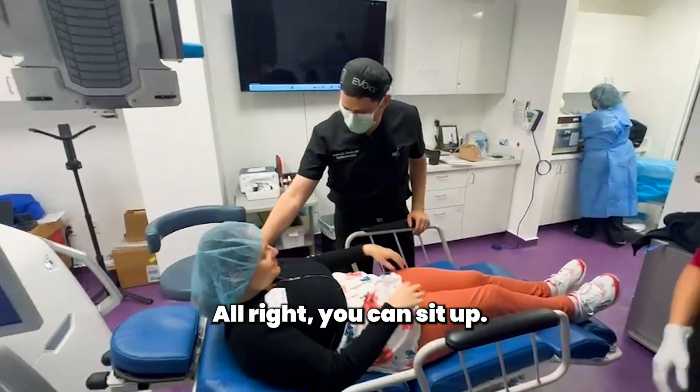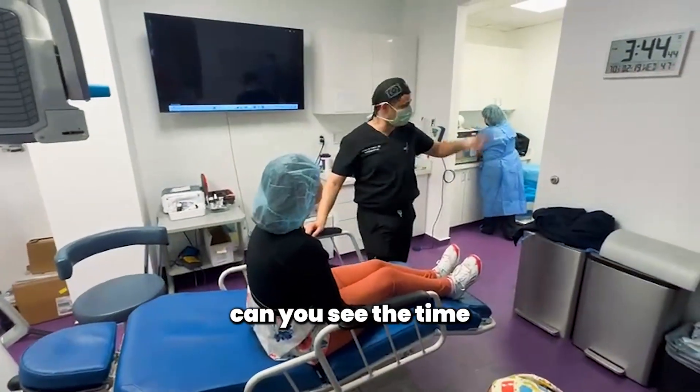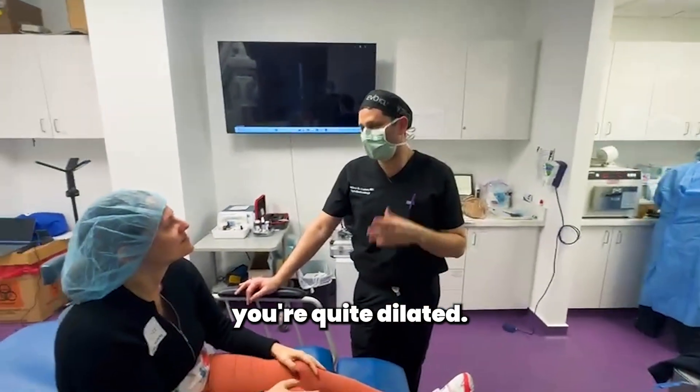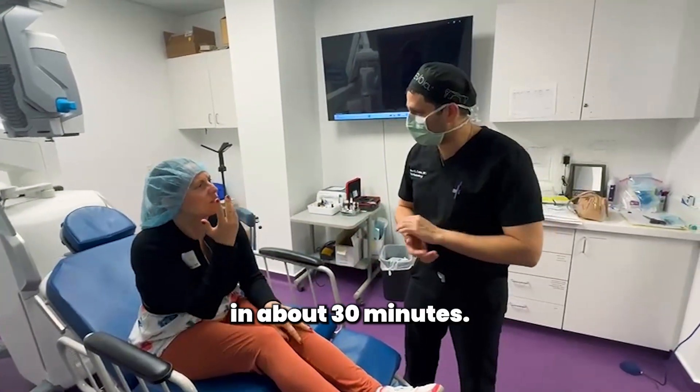Okay, go ahead and sit up. How are you feeling? Good. Can you see anything? Can you see the time? Yeah. Perfect. So obviously you're quite dilated. It's going to be a little blurry for the next day or two. We'll check your pressure in about 30 minutes.